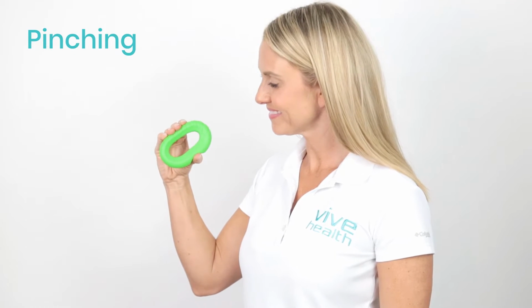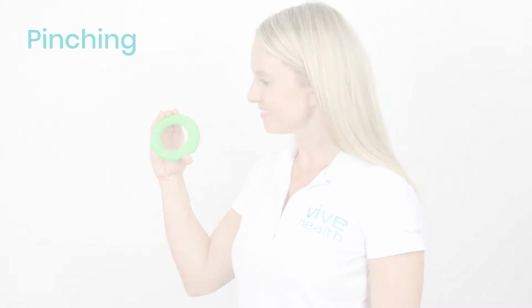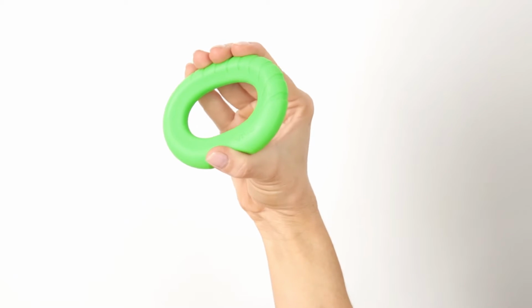Exercises. Pinching. Squeeze with the ring between your fingertips and thumb.